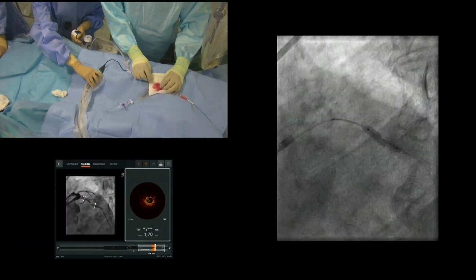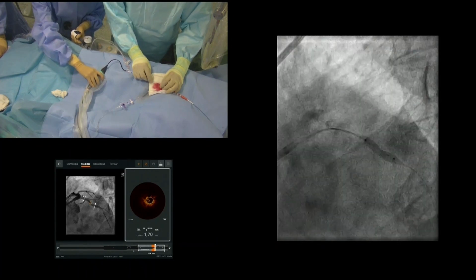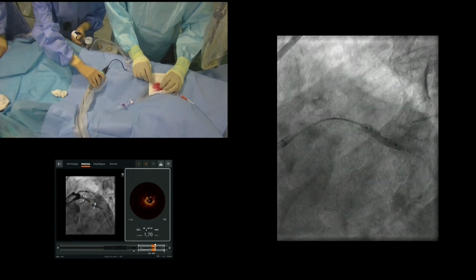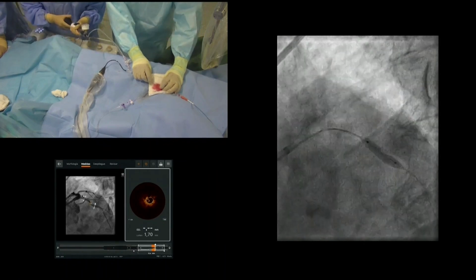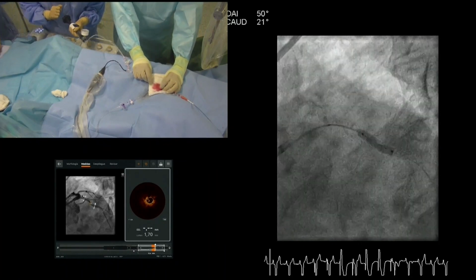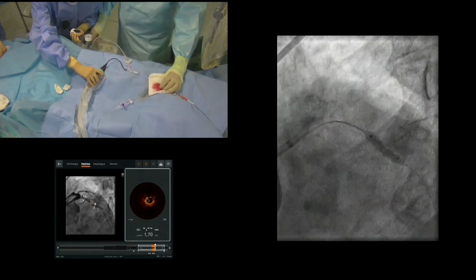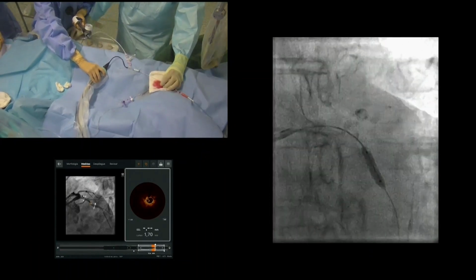Yeah, but it improved already from the first shocks, and you can see it improving. And you can see the generation of CO2 bubbles inside the balloon as a consequence of the sparks. Okay, I mean, it looks very good. Definitely looking better. Yeah, looks very good already.